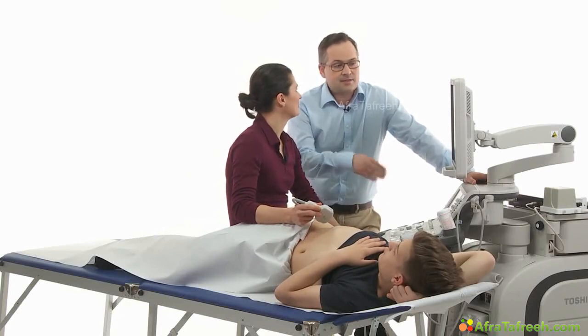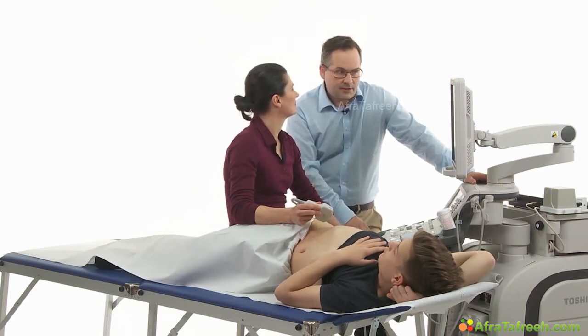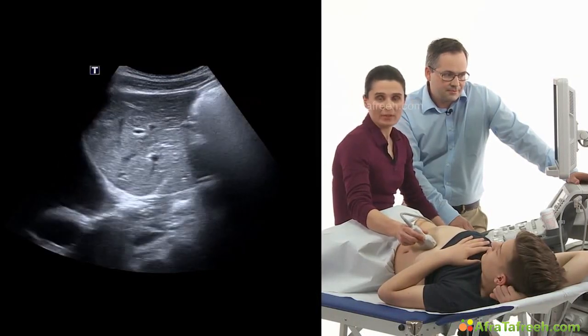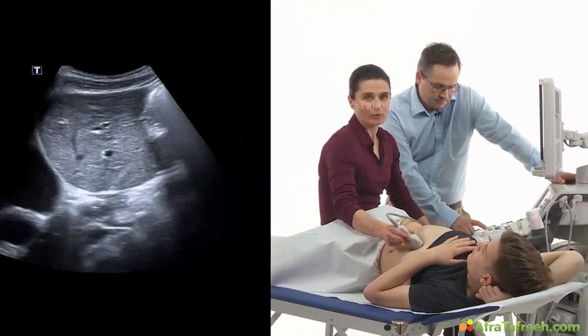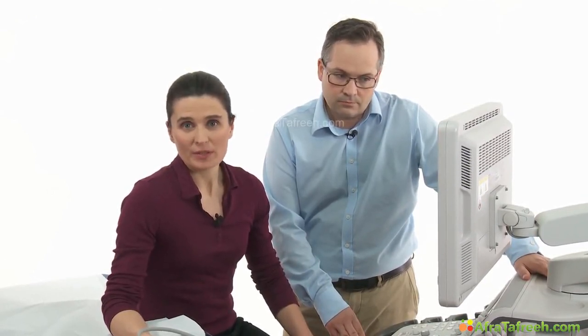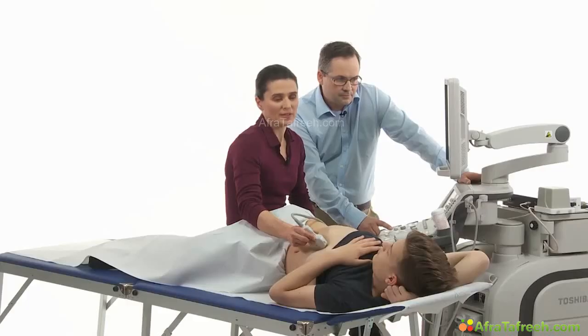The patient is placed on his left side, raised the arm above the head, and we go on with the scan of the right liver lobe. I place my transducer again in the epigastric area in a longitudinal position, and now I perform a sweep to the right side of the patient. Since the liver is a quite large organ, we cannot scan it at once. So on a first sweep, we focus on the cranial parts, and on our way back, we sweep the caudal parts of the liver. Okay, please inhale.